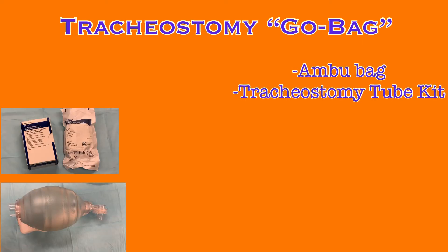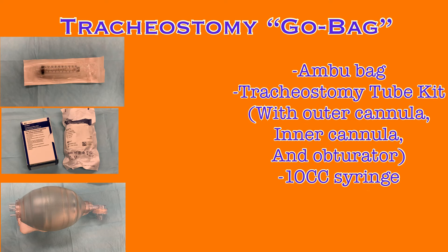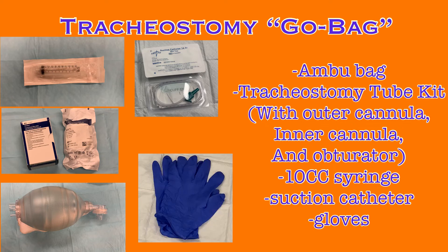Before the patient leaves with transport, ensure they have their tracheostomy go bag with them and that it is fully stocked. The go bag is a collection of supplies that should always be with the patient in case of a respiratory emergency when they are away from the room. They should have an Ambu bag, a full tracheostomy tube kit of the same size currently in place or one size smaller — including the outer cannula, inner cannula, and obturator — so that a new tube can be placed quickly if necessary. They will also need a 10cc syringe so the cuff can be inflated if the patient requires ventilation, a suction catheter, and gloves. These items should remain with the patient at all times while away from the room.